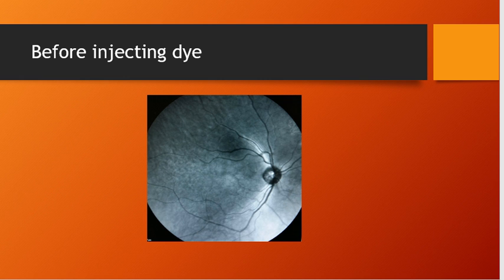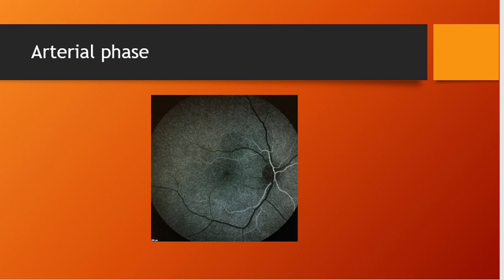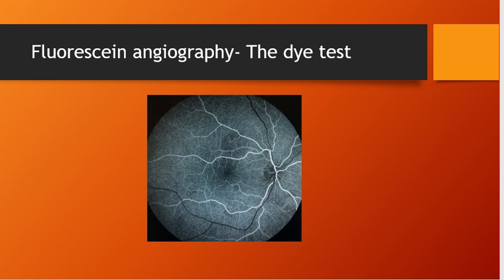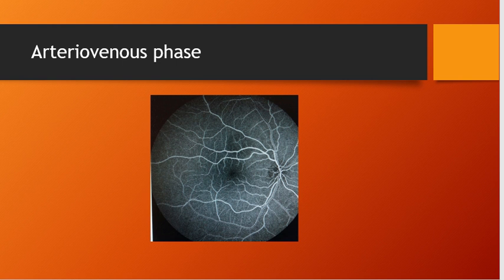Looking at a normal fluorescein angiogram: the first picture shows the fundus image before the dye is injected — blood vessels appear black in this red-free photograph. In the arterial phase, you can see white lines which are the arterioles filled with dye, while the veins, appearing as black lines, are not yet filled. In another arterial phase image, the arterioles are completely filled while the veins are still black, confirming this is the arterial phase.